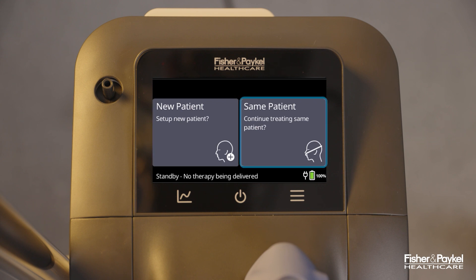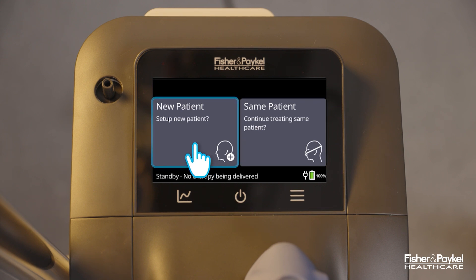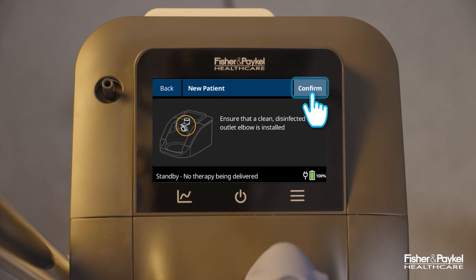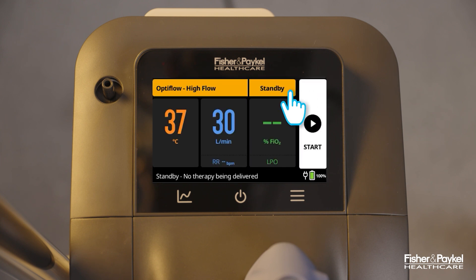Select a new patient, or select the same patient to resume therapy for the same patient. For a new patient, ensure that the outlet elbow has been cleaned and disinfected. Select confirm to continue.